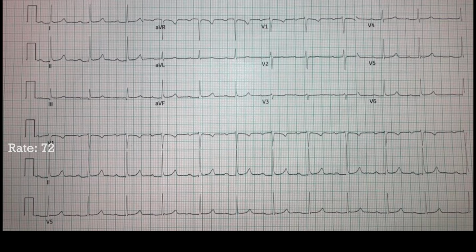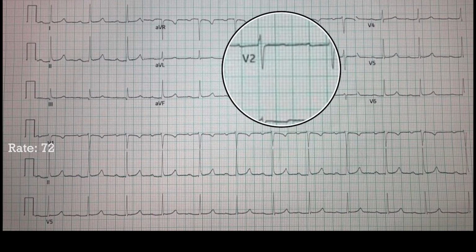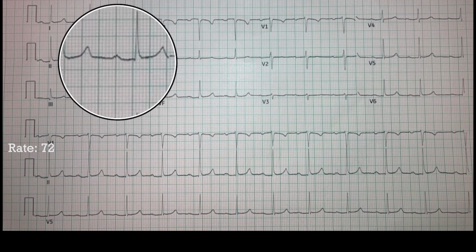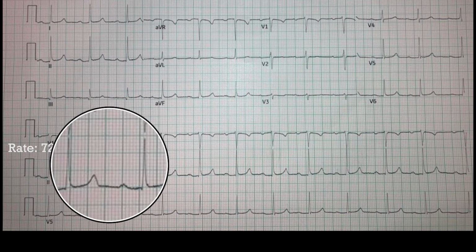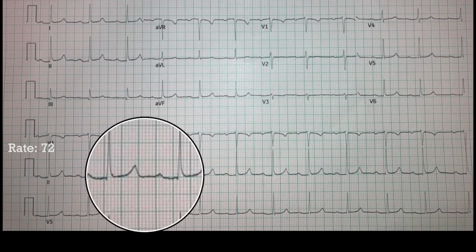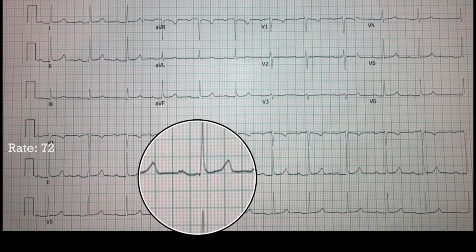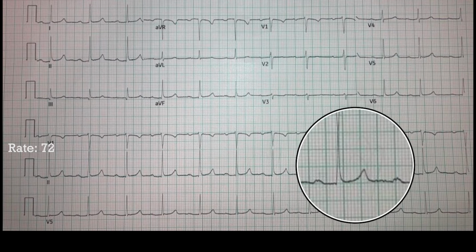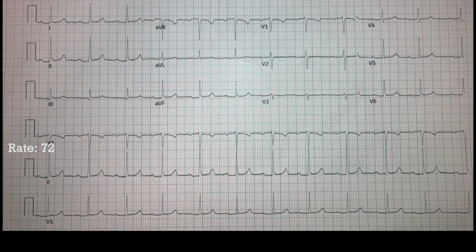Rhythm. When we look at this, we see that there are QRS complexes and they are preceded by P waves. Looking down here at the longer strip, there seems to be a P before each QRS, a P before each QRS, a P before each QRS, all the way through. So that looks like probably a sinus rhythm.